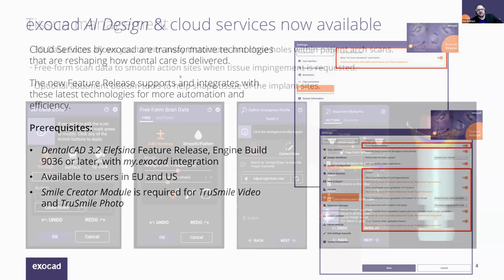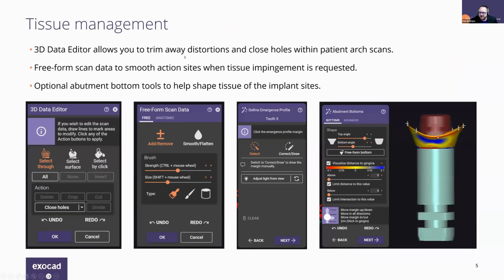So let's go ahead and proceed. Throughout today's session, we're going to be covering different topics. I know we only have an hour, so we'll try to open up some options to show different ways to go about things. But with tissue management, so all on X, there's times you might be working on fresh implant sites, more of immediate load scenarios, or sites that are completely healed, with the tissue shaped the way you're wanting to achieve.